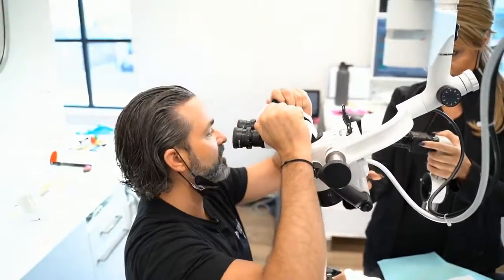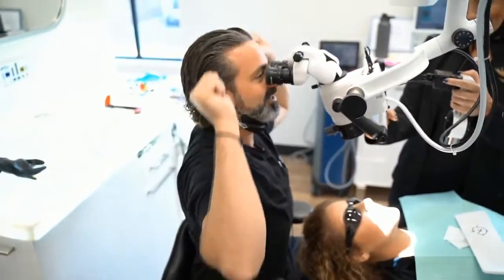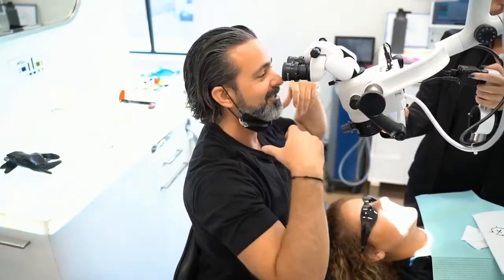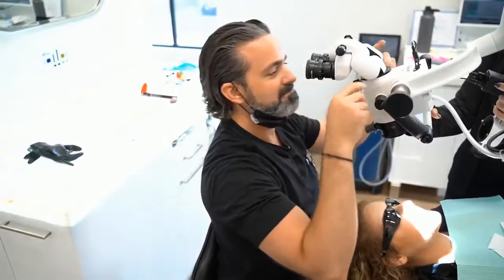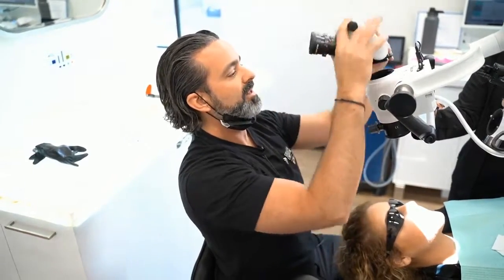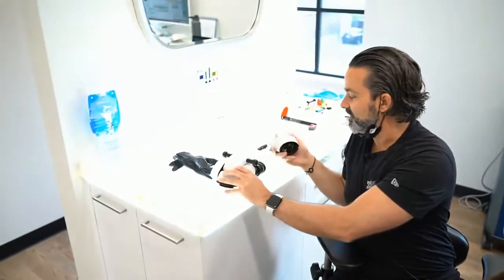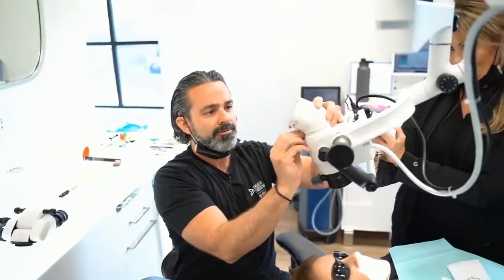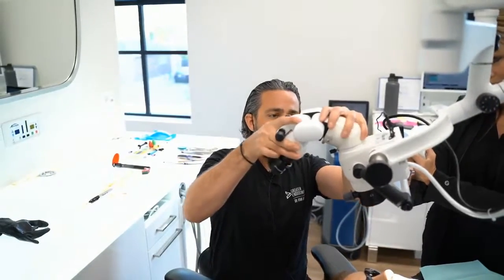So look at my shoulders now and how I'm lifting up. I mean, I can do military presses and would probably look fantastic with some really fantastic shoulders, which I don't have, obviously, because I work too much. If I were to flip it like I did with this device, I'll show you what it does to my shoulders. So we can see this extension now.